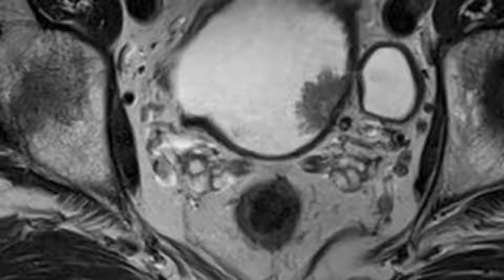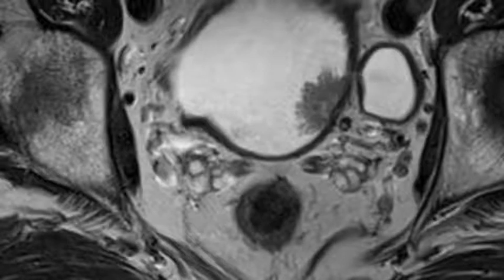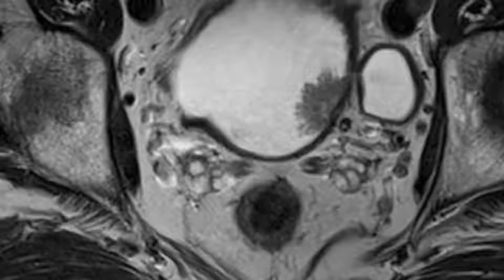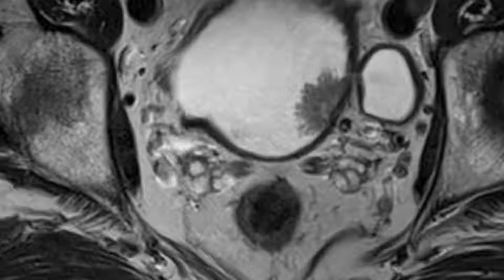The bladder tumor, mucosa, and submucosa enhance early, but the muscle layer maintains its hypointensity and enhances late, at 60 seconds. This early phase of contrast enhancement also helps distinguish the bladder tumor from the low signal intensity urine.